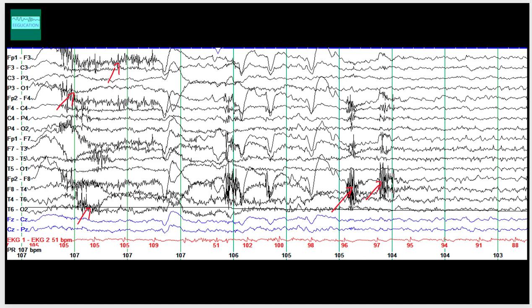What else do you see? You see a lot of eye blink artifacts — this is the eye blink artifact here, and here. Eye blink artifacts usually have maximal amplitude at FP1 and FP2, since those two contacts are closest to the eyeballs. When the eye blinks and the cornea moves upwards, those are the channels that get most influenced.